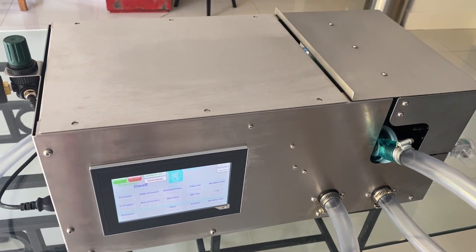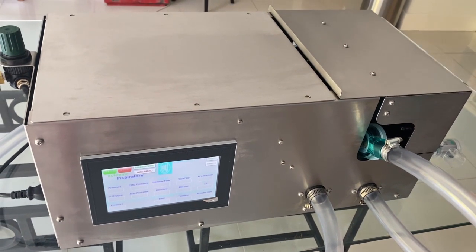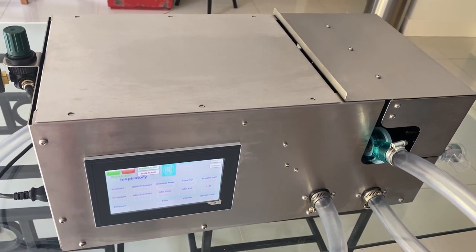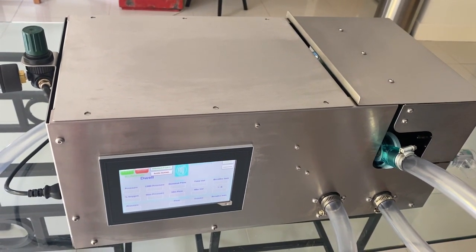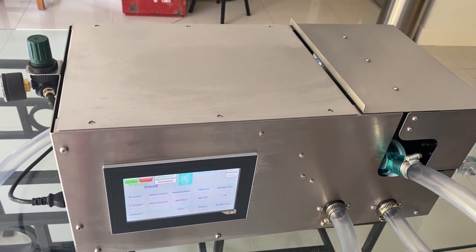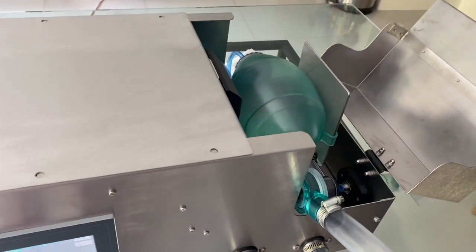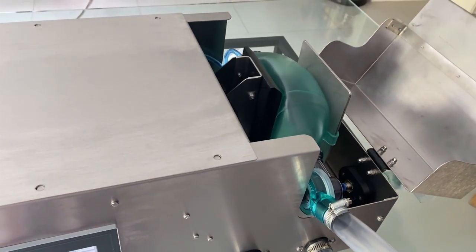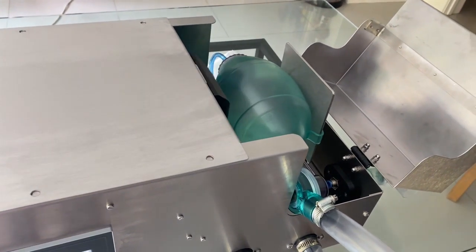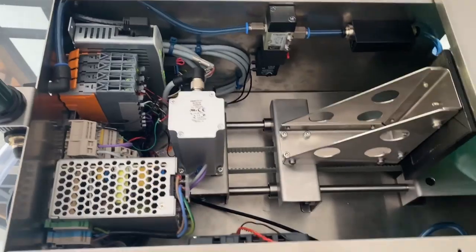Throughout this process, our overriding design philosophy was to use medically approved parts wherever possible and to use as generic components as we could. With this in mind, the prototype ventilator developed by our design team of Gareth Davis, Richard Little and myself is based on a BVM system. This has the advantage of already being medically approved and readily available. As it includes overpressure and PEEP valves, it also addresses most of the intrinsic safety concerns.